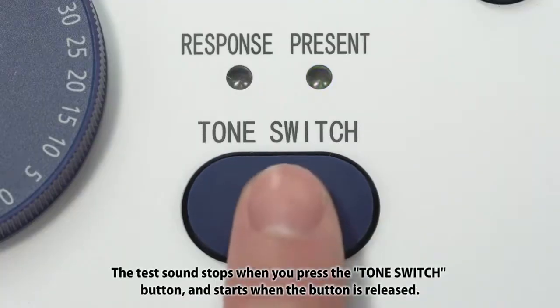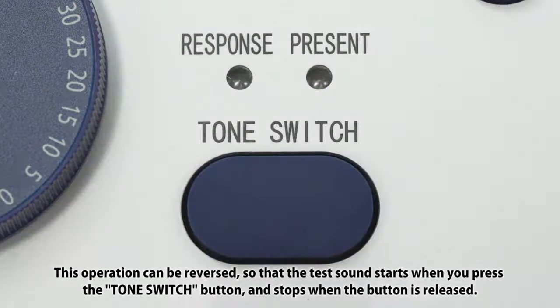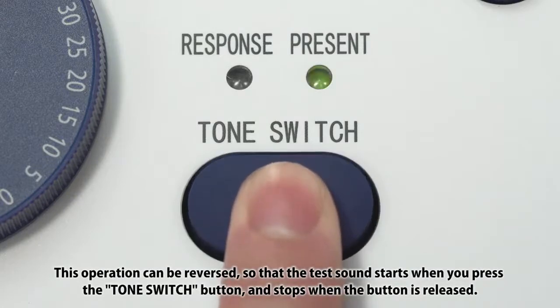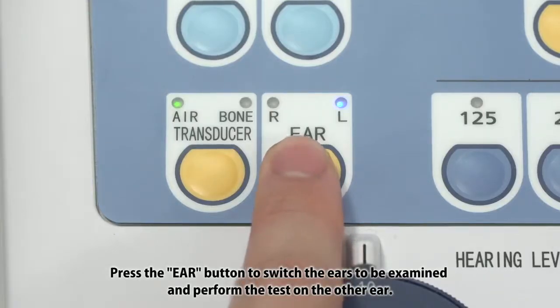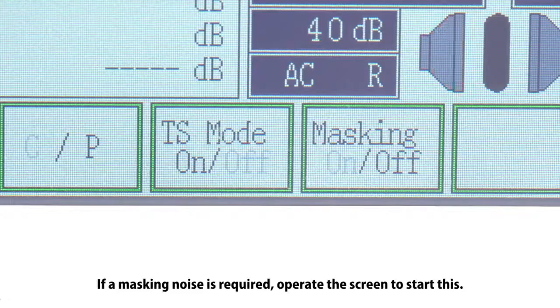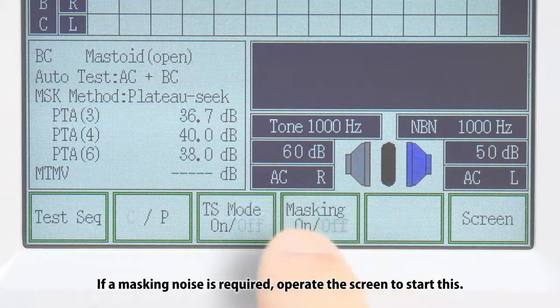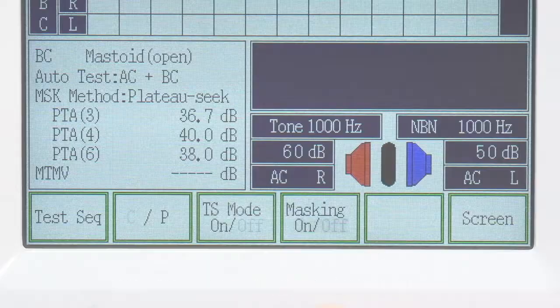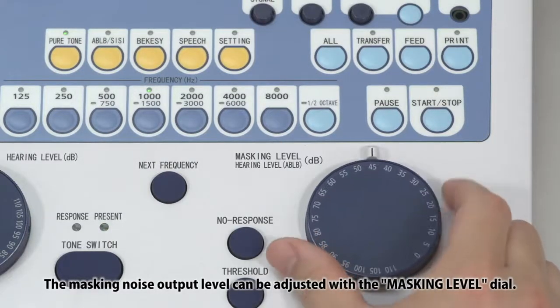The test sound stops when you press the tone switch button and starts when the button is released. This operation can be reversed so that the test sound starts when you press the tone switch button and stops when the button is released. Press the ear button to switch the ears to be examined and perform the test on the other ear. If a masking noise is required, operate the screen to start this. The masking noise output level can be adjusted with the masking level dial.